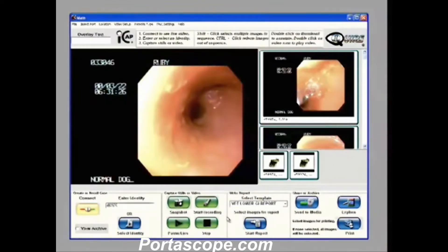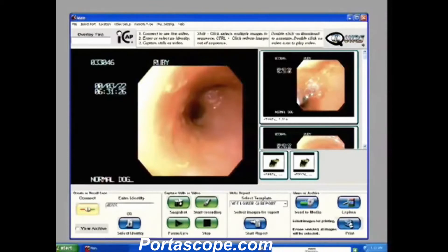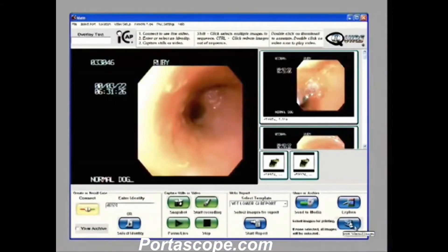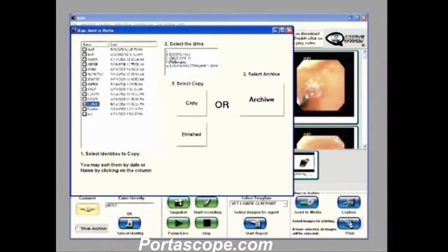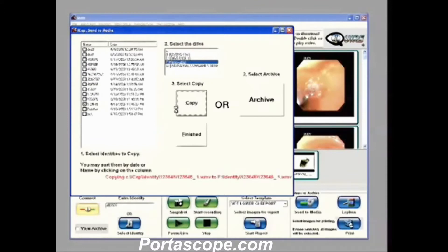We can easily print these images out by just clicking on the print icon over here. We can send them to media, record them to DVD or flash memory. We'll come up here and select the case, put it on my removable drive, and just hit copy — and there you go. It copies right over to my removable drive. When I'm done I can just hit finished.